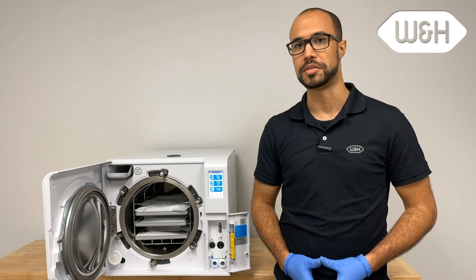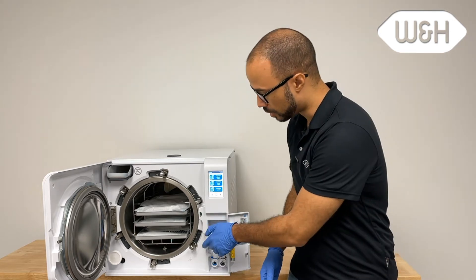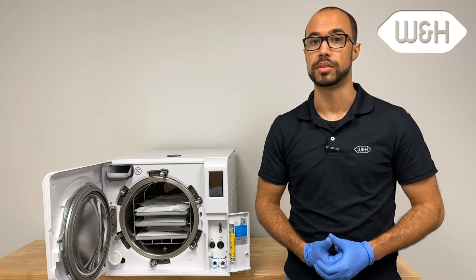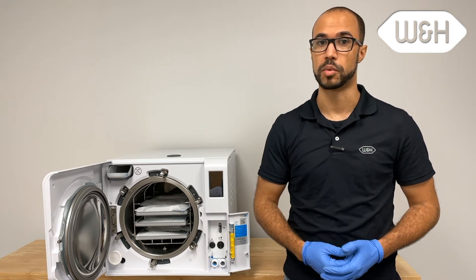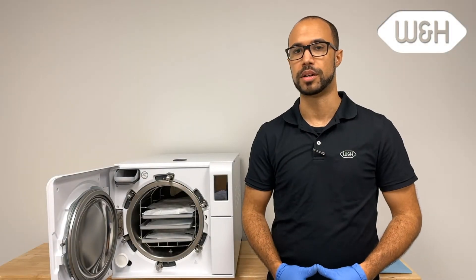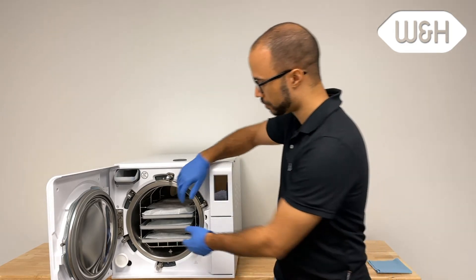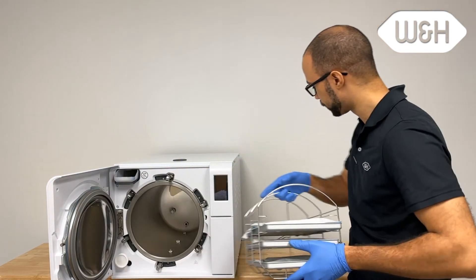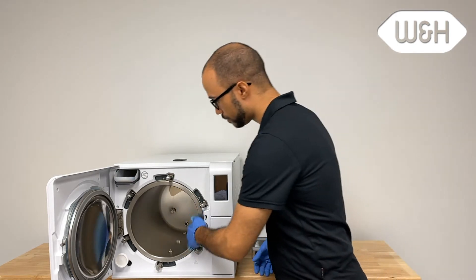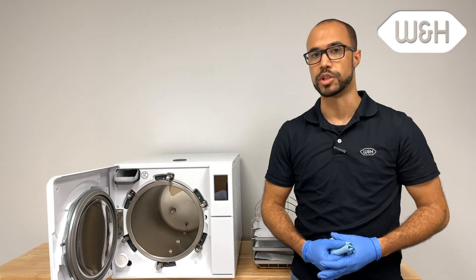Prior to cleaning the Lexa sterilizer, it's important to ensure that the chamber is not hot. Do this by switching off the Lexa and allow time to cool. Once a month, you will need to clean the Lexa. Keep in mind there is no cleaning cycle — the cleaning process is manual, by wiping down the Lexa with a clean microfiber cloth. Take a clean microfiber cloth and wet with clean water. Remove the trays and rack from the chamber, then wipe down the Lexa chamber and any other surfaces. You do not need to use a cleaning solution; clean water only.